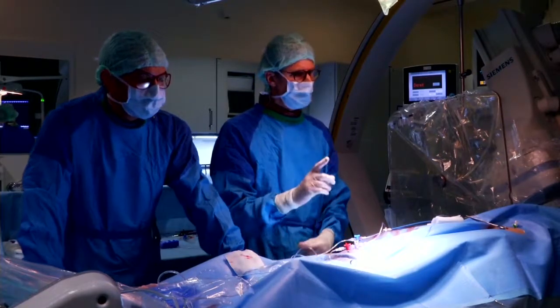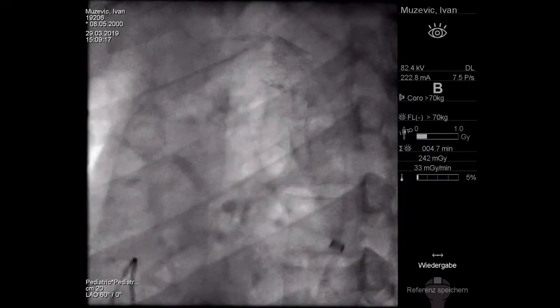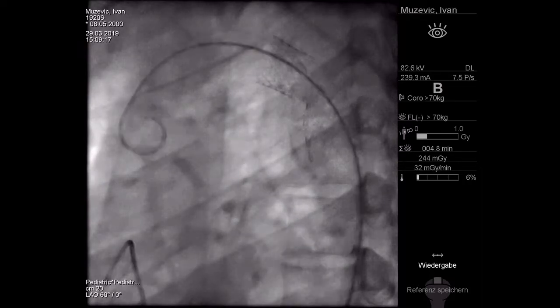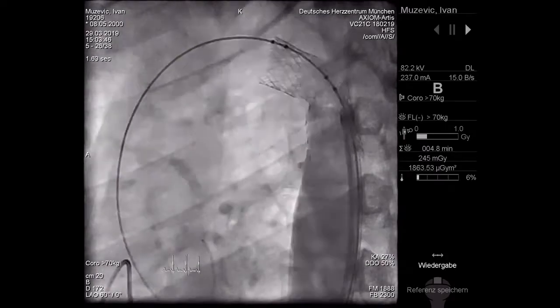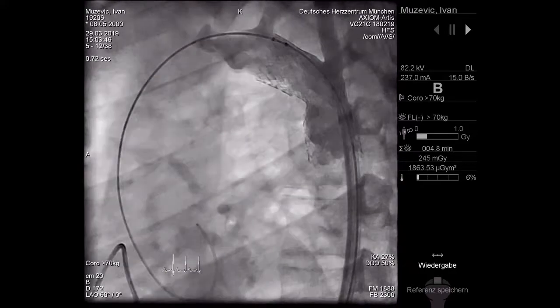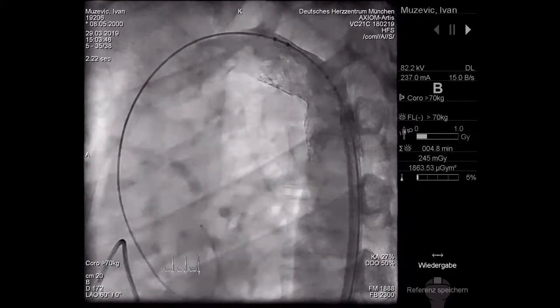So let me first do the pressure measurement. Chuck, yeah. Peter, could you play that angiogram again, or are you going to fluoro now? The hand injection after the deployment, the last one you've done. Because the impression I have is that at the distal end of the stent on the inner curvature, there is a little kink in the vessel, isn't there?